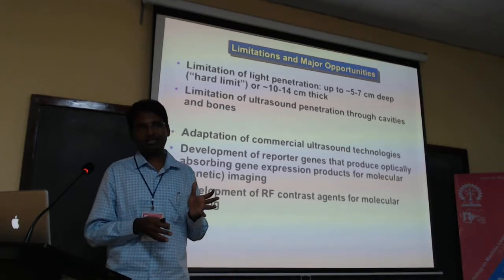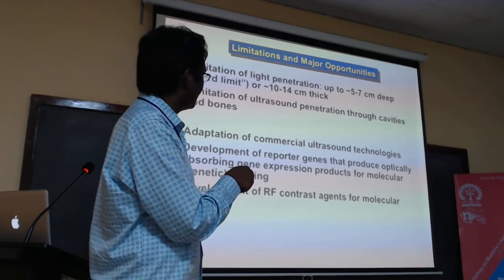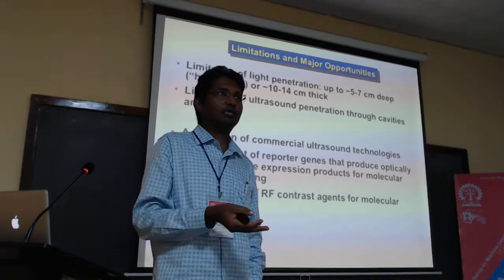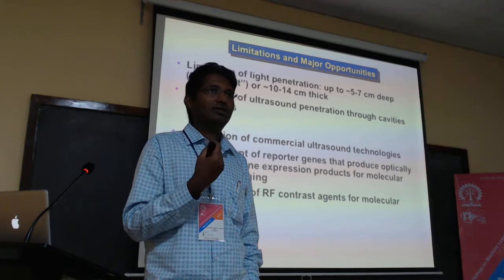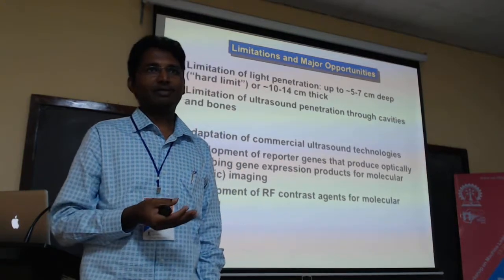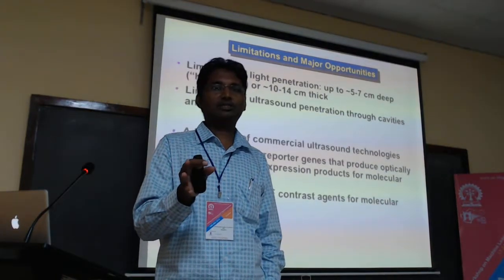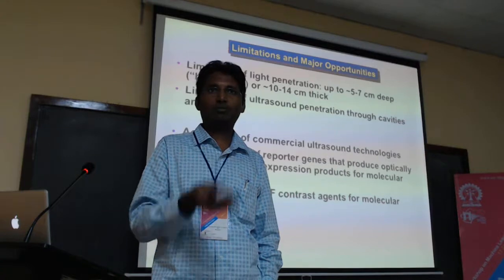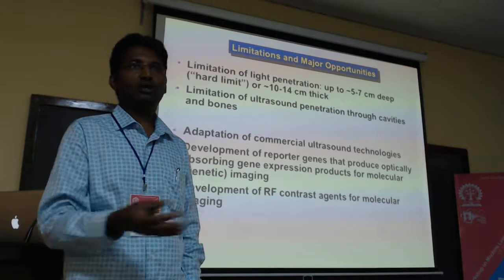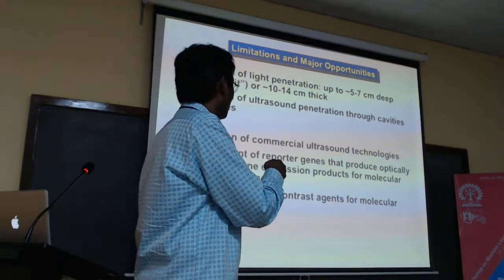Now, currently, what are the limitations of photoacoustic tomography? We are limited by the light penetration. Ultimately, your light has to be absorbed by the tissue so that you can really see the photoacoustic effect. That means that if your light is non-penetrable, then there is no way we can get a signal. Currently for soft tissue, light beyond 5 centimeters doesn't get penetrated within the ANSI limit of the laser source. Beyond 5 centimeter depth, coverage is extremely difficult for optical methods. So beyond 5 centimeters, you cannot get the resolution, because no photoacoustic signal is getting generated. That's one issue which you are having. So can you go up to 10 to 14 centimeter thickness?